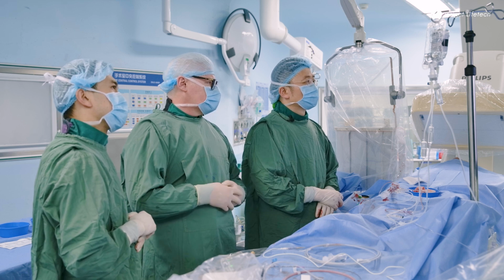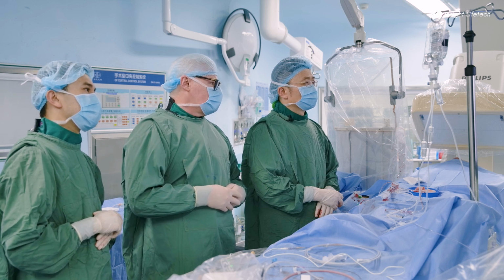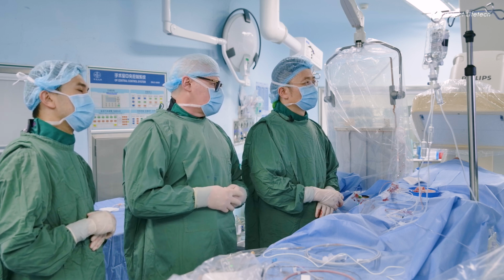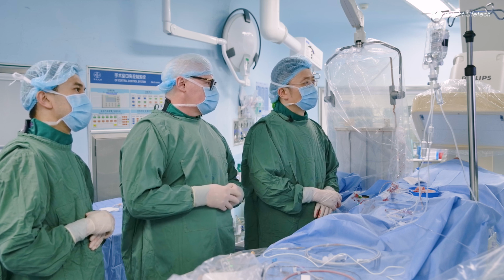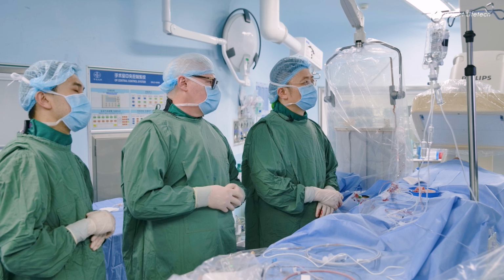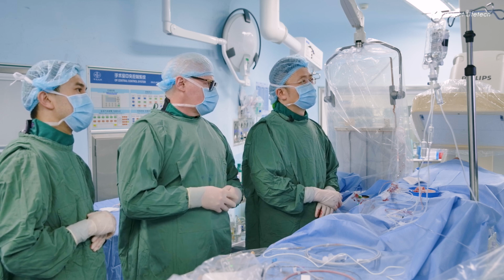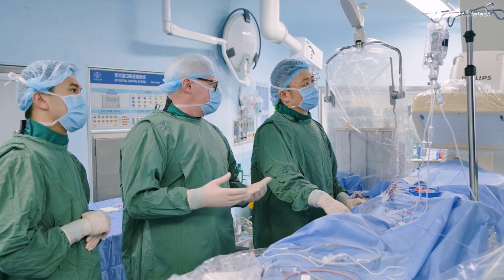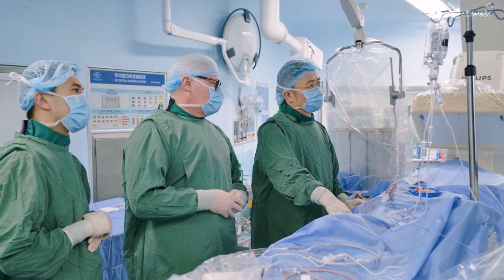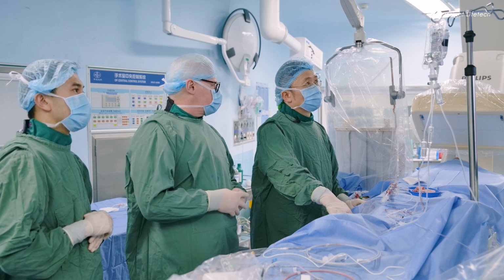So your decision was to cover all the proximal and mid part of LAD with stents, and it was a good decision. And then you did this overlapping stenting, optimized stenting with high pressure post dilatation with balloons sized according to IVUS. And at the end, we have not only an optimal result by angio, but also by IVUS, and especially by physiology.